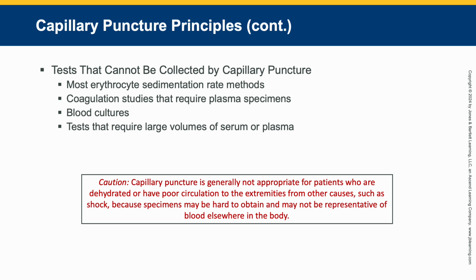But you can't do a capillary stick into this light blue top. Make sure you make note of that, okay? Only taking a small amount of blood from a syringe and putting it into the microtainer will work that way. You can't do it with a finger stick.